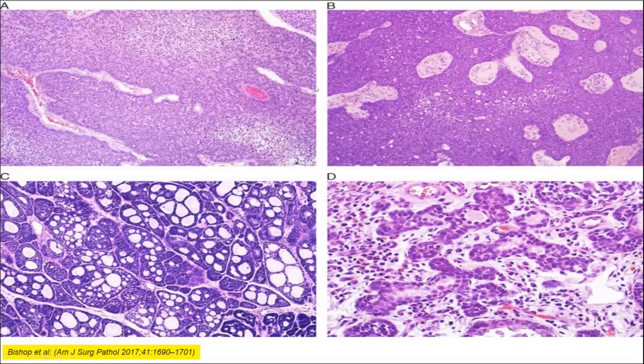So these upper two panels are more of this undifferentiated carcinoma phenotype, often mimicking a non-keratinizing squamous cell carcinoma. But then you have these areas, and this looks very much like adenoid cystic carcinoma, some areas that had more tubular growth.